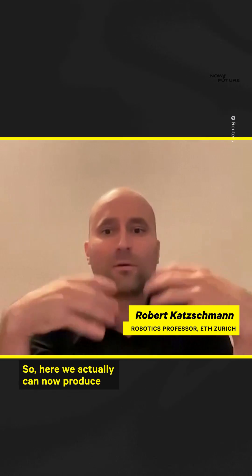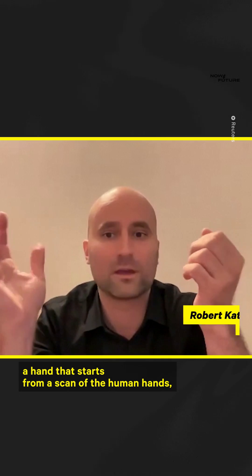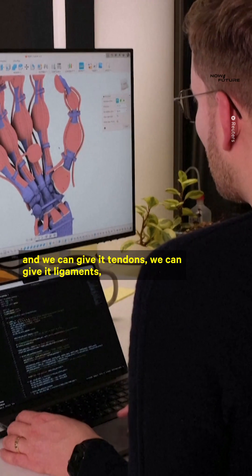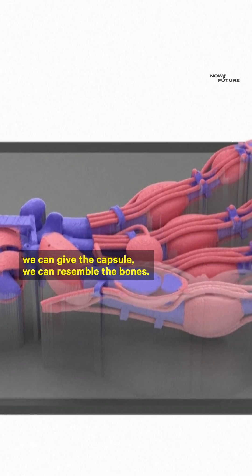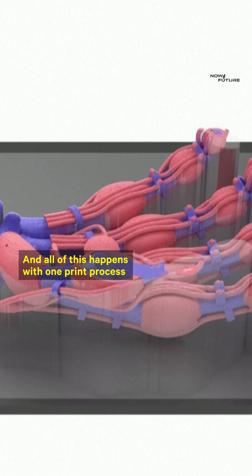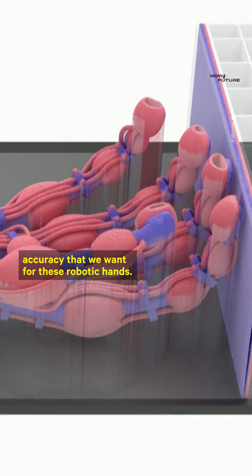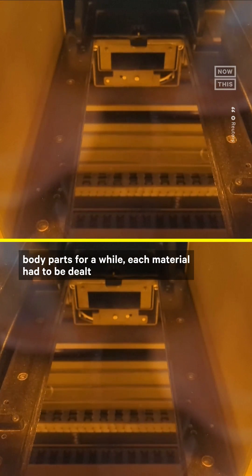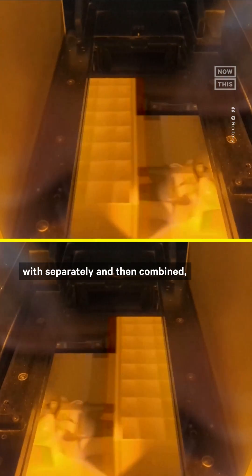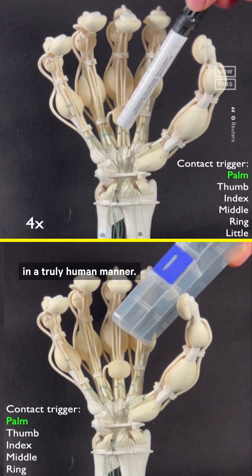We can now produce a hand that starts from a scan of a human hand, and we can give it tendons, ligaments, a capsule, and resemble the bones — all of this happens with one print process that allows us to get the accuracy we want for these robotic hands. Katzschmann noted that while we have been able to 3D print body parts for a while, each material had to be dealt with separately and then combined, meaning that previous versions could never react in a truly human manner.